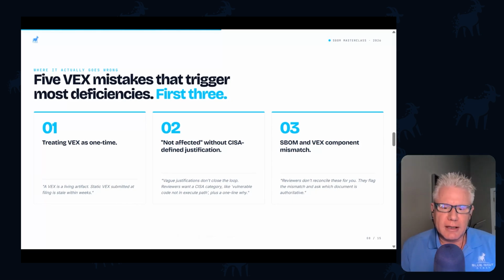The number 2 is often people say that the component that makes up the SBOM is not affected. That is okay to say it's not affected, but you need to justify why it's not affected. And that could be the code is not an executable path.